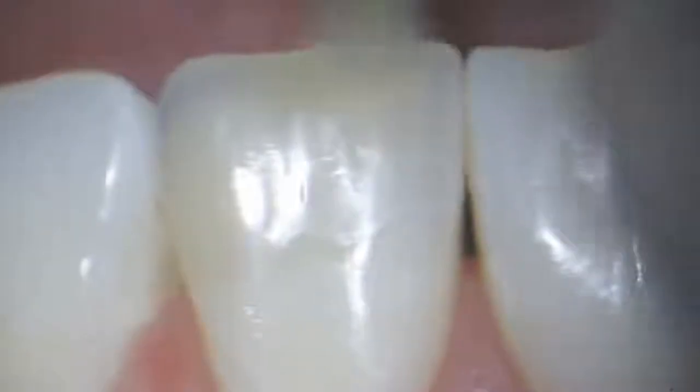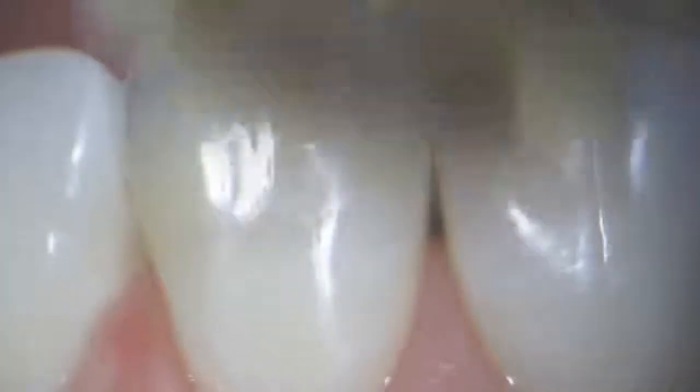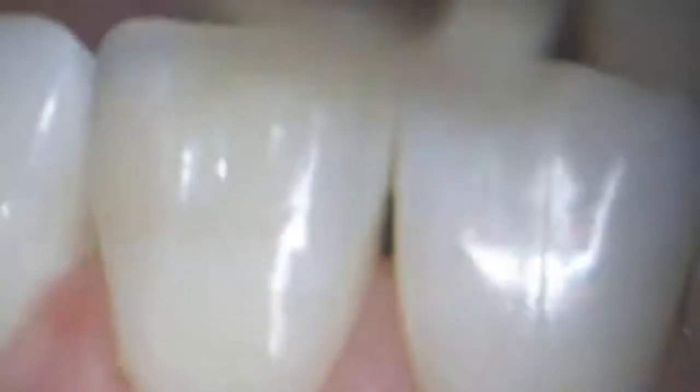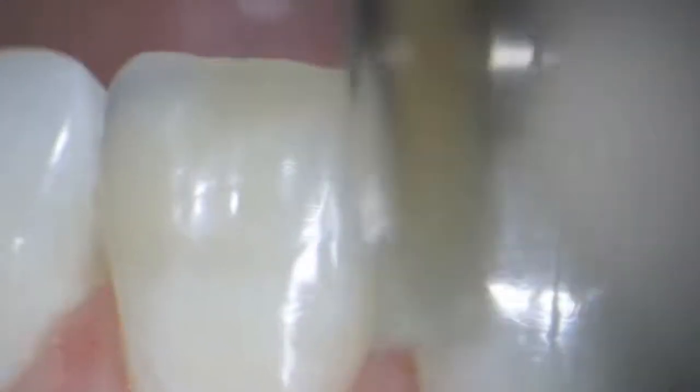This brush also affects the composite surface very volumetrically, and we can reach all zones, even very hard to reach. The gloss becomes brighter.